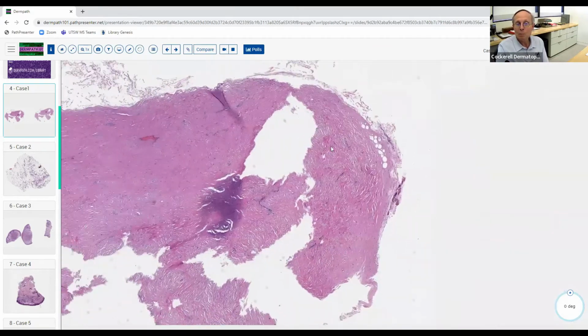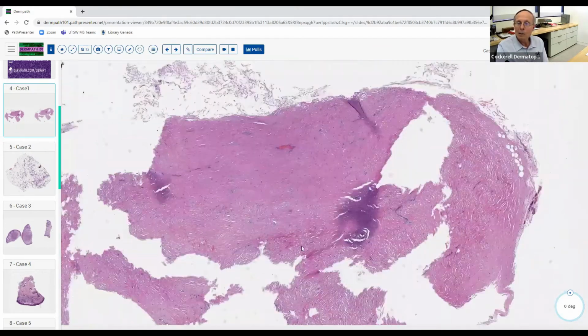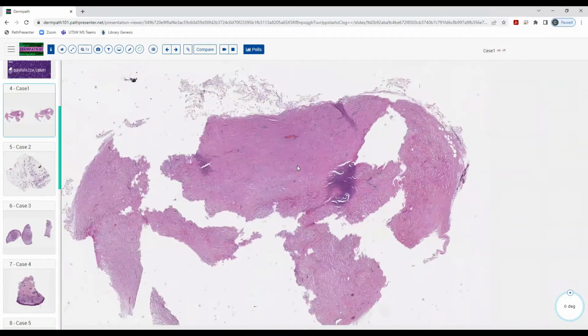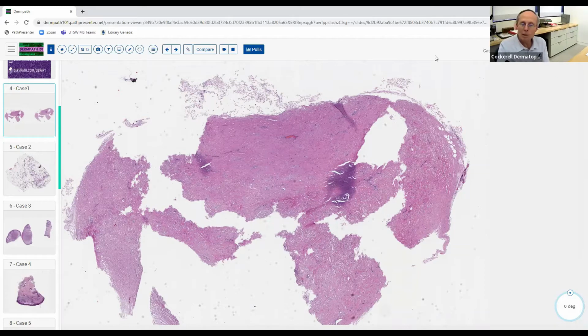I think your description is pretty good. Do you think it's benign or malignant just based on this? I think it's benign. Just looking through, I don't see atypical, hyperchromatic cells sticking out in the dermis. Yeah, unfortunately, it is fragmented. We don't really have the whole thing, but it seems like it's got a fairly round edge here. And if this were the whole thing, it looks fairly symmetrical. It's a suboptimal specimen because it's fragmented, like you said. And then you say, well, it's probably benign.